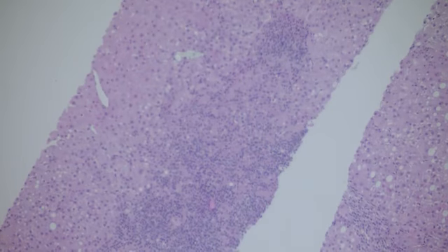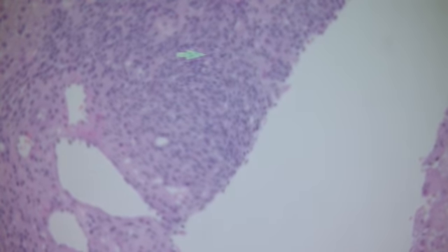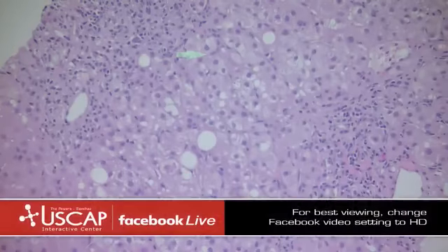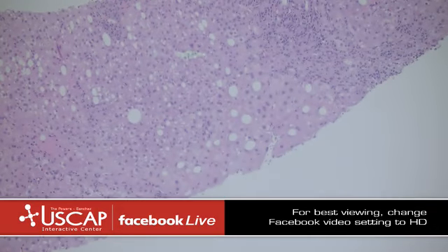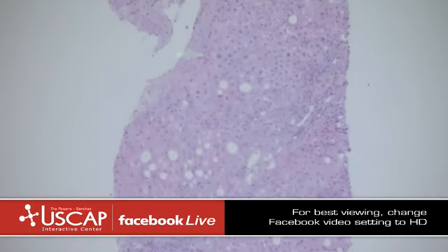So maybe a chronic hepatitis pattern. So what's everybody thinking? Chronic hepatitis pattern, there's lots of lymphocytes. Don't see plasma cells, don't see a lot of mixed inflammation, saw a few EOs. So overall, it's a chronic hepatitis pattern, right?